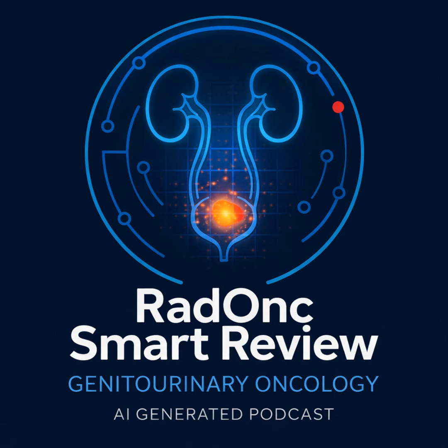Like a nuclear medicine scan, right? Right. MAG3 or DMSA scan. Yes. A CT scan can tell you the physical size of the kidneys, but it cannot tell you how effectively each kidney is filtering blood. That makes sense. You might see a massive tumor in the left kidney and assume that kidney is completely non-functional, only to run a MAG3 scan and discover that the left kidney is actually providing 60% of the patient's overall filtration.